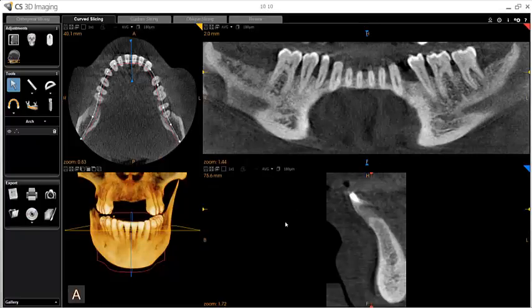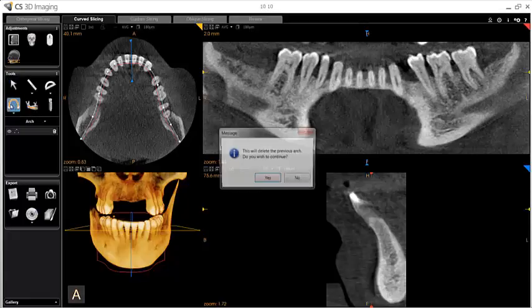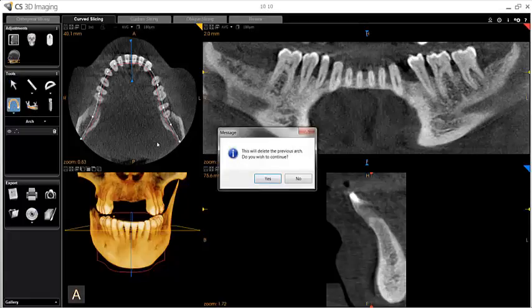To delete and redraw an arch curve, simply re-click the Manually Create an Arch tool. You'll be prompted to confirm that you want to delete the existing curve. Click Yes and you may redraw your panoramic arch.